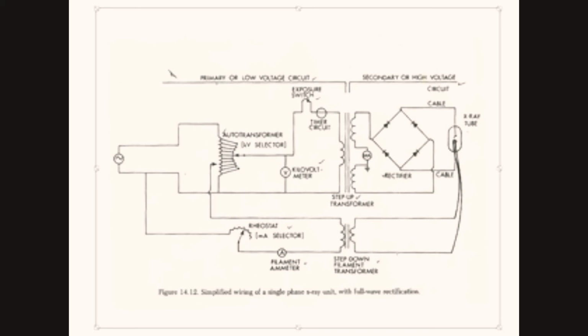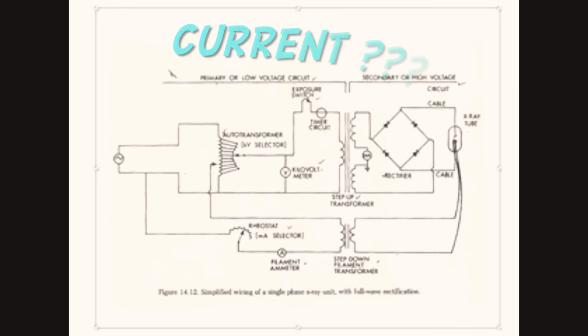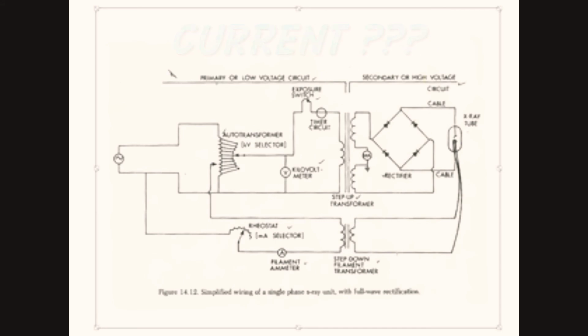Extra current. Up next we have the mA selector, also known as a variable resistor or the rheostat, which basically is a major element of the X-ray component because it provides the current to the filament. Current being the electrons by thermionic emission, or the process also called boiling off, or a cloud of the electrons. The mA selector normally ranges from 10 to 1,200 mA.